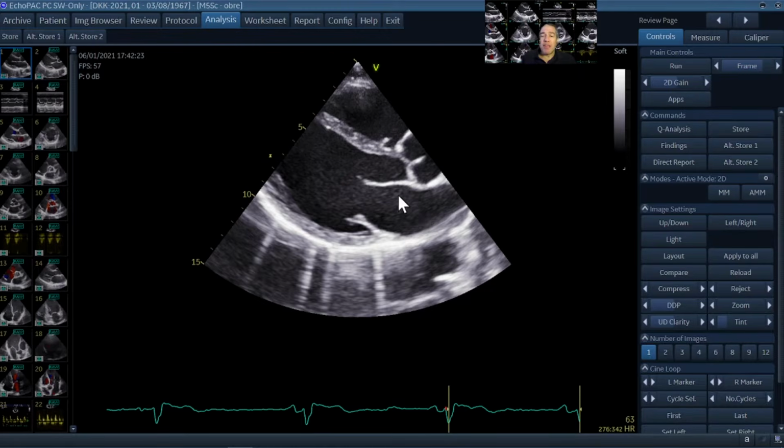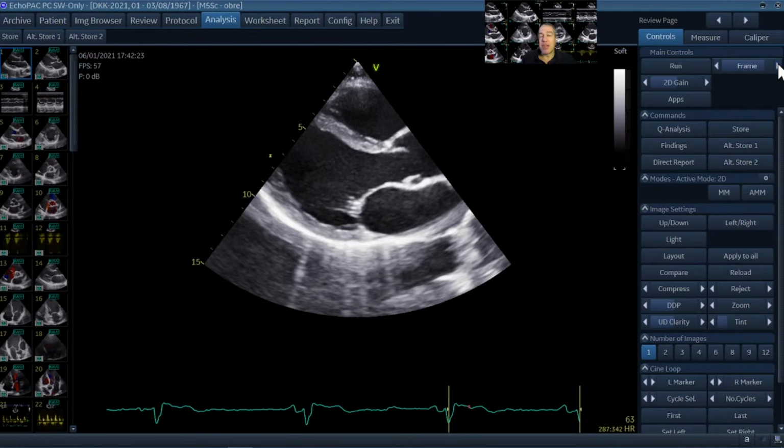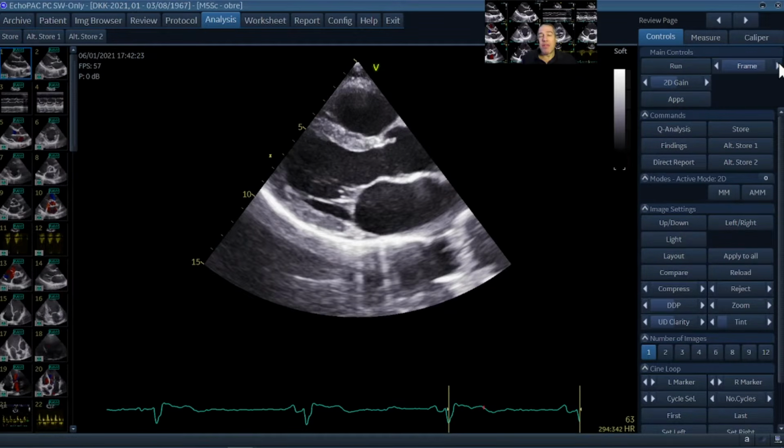However, I start my measurements in the left atrium, and for the left atrium we need the maximum diameter, and that is during left ventricular systole, which corresponds to atrial diastole, so the maximum atrial filling. For that purpose I continue to go frame by frame to the right side in the cycle, so later in the cycle. And now I have to define end systole.